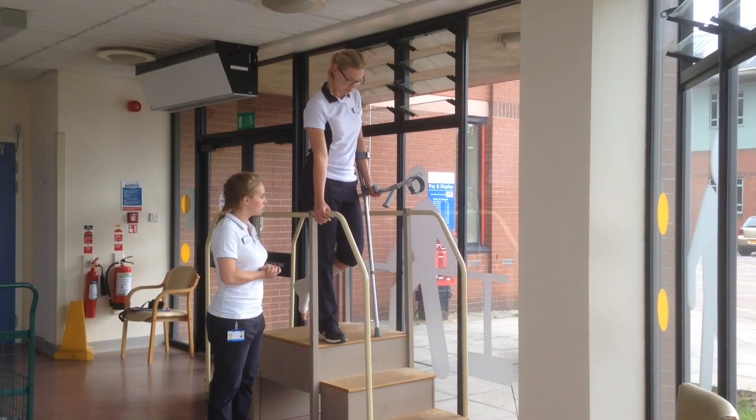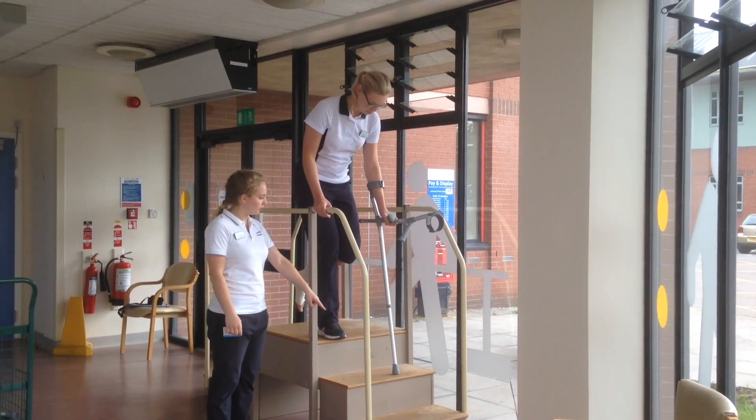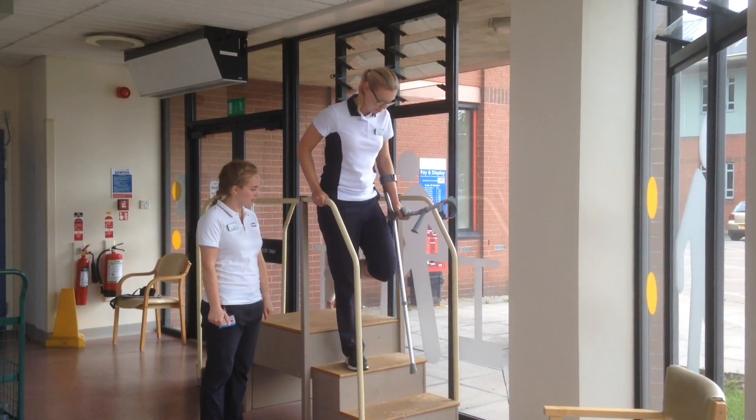Using the banister for support, put your crutch on the step below. Weight through both of your hands, hop down gently to it.